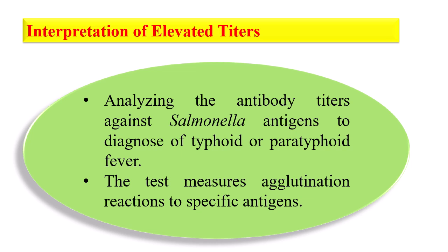This test measures the agglutination reaction to specific antigen, and the main criterion is the measuring of agglutination.